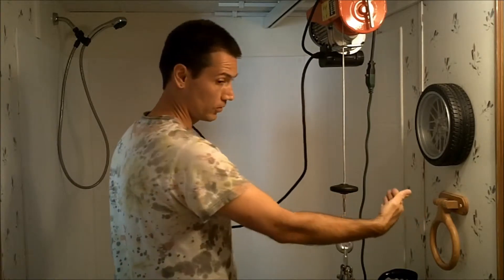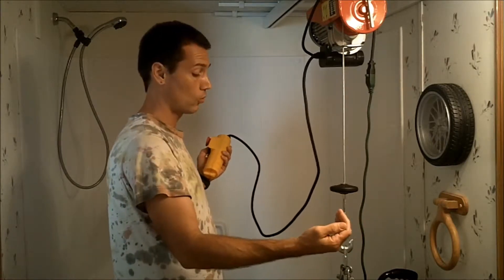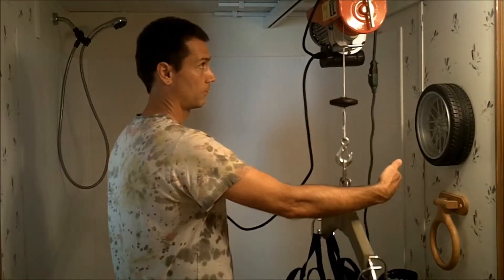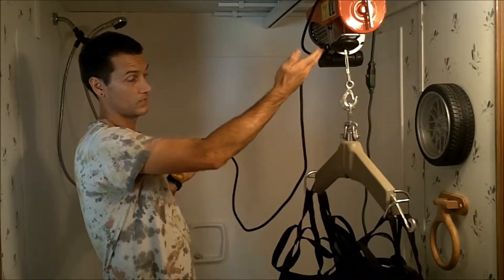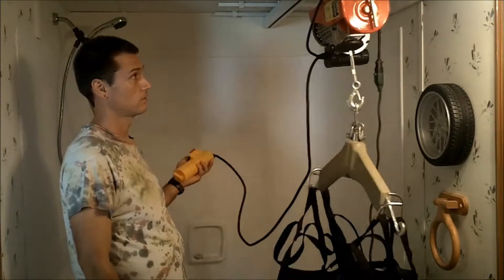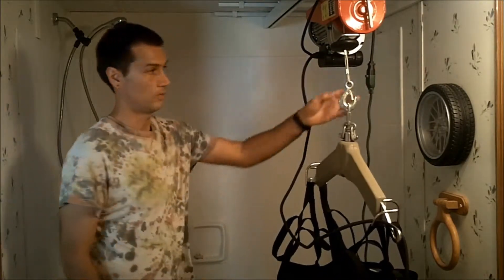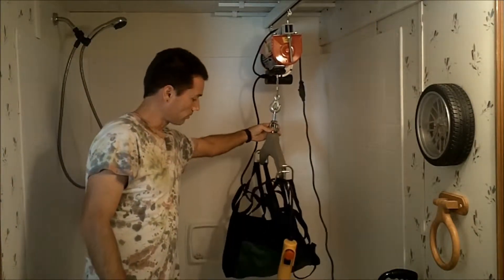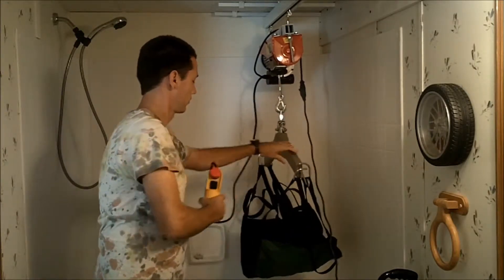You always want to make sure you have your hand supporting the head — if he has little control of his head or neck muscles, or has a tendency to bob his head around, put your hand behind the head. Raise it up. This does have an automatic stop when it reaches the top, so it stops itself, or you can stop it at any point and it locks in place. He's now above the tub — slide him over until he's centered, and lower him into the tub.